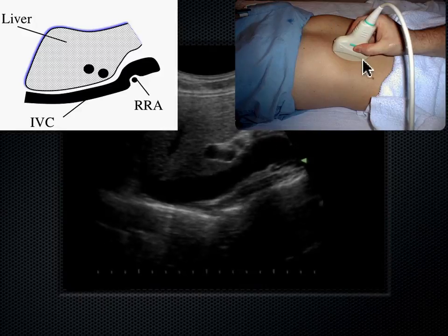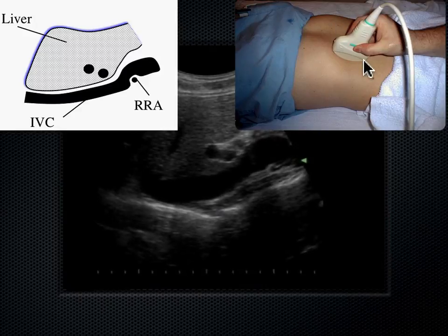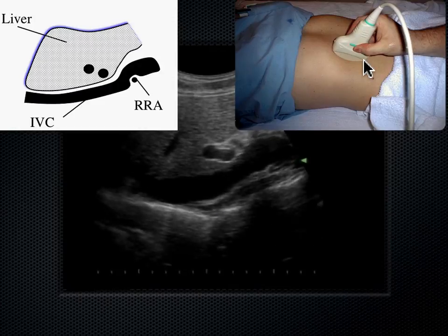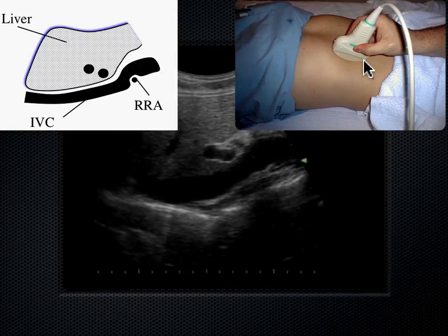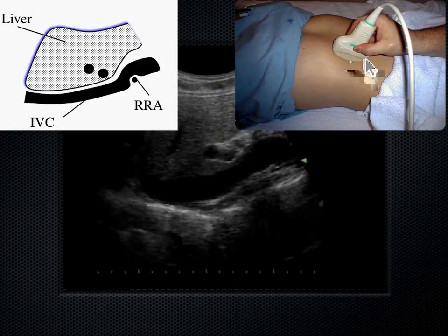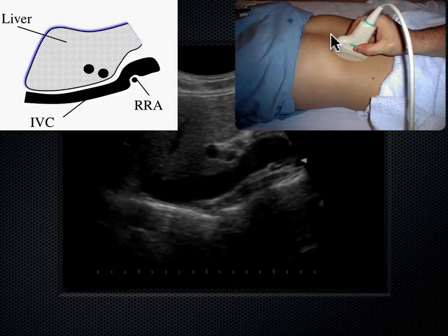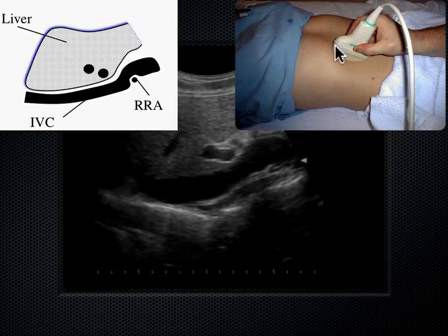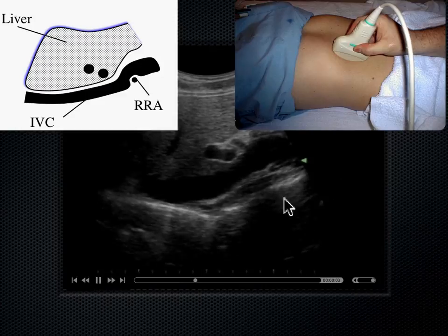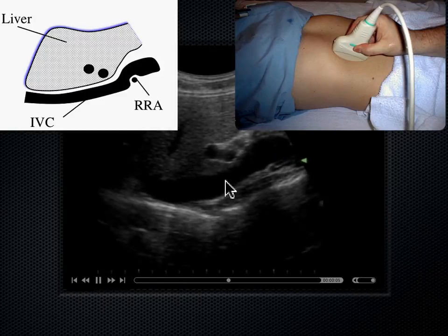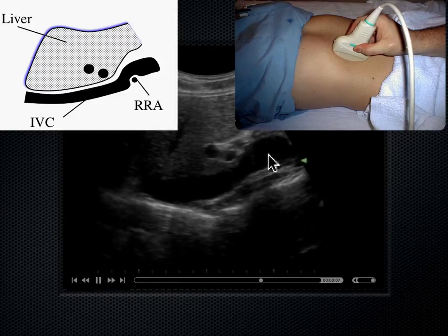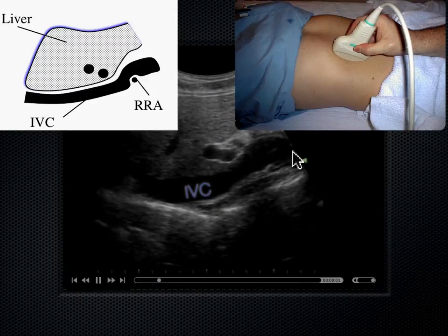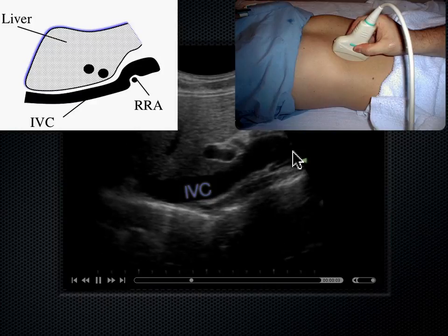Looking at probe placement: this probe is in a parasagittal right axis. 'Para' means next to, and 'sagittal' means the longitudinal anterior plane. This is just to the right of the body's midline, where we see a vessel coursing underneath the liver. That vessel is the IVC — the inferior vena cava — which runs up the right side of the body.